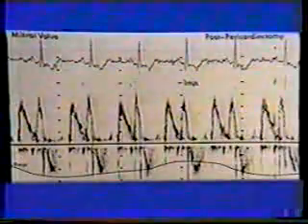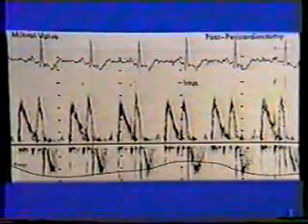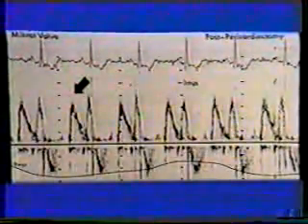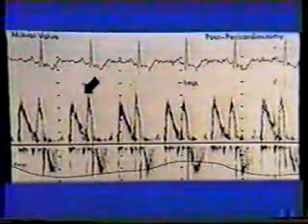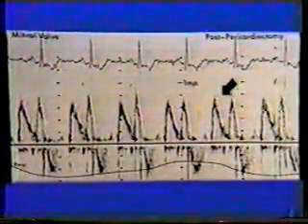This patient underwent successful pericardiectomy. Postoperatively, the mitral velocity profile has returned to normal. There is no significant variation in the time velocity integral with respiration.